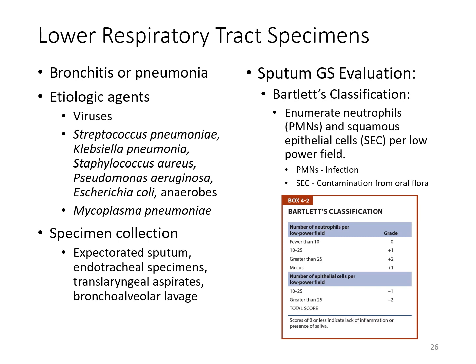With your sputum cultures there, your gram stain evaluation is also going to include the enumeration of your neutrophils as well as your squamous epithelial cells. And this acts as a quality control to make sure that you got a good quality specimen, and that the specimen has not been contaminated with other oral fluid, saliva, things like that. You'd want to be testing the fluid that's coming from deep in the lungs, and not fluid from the throat or oral cavity, saliva, things like that.